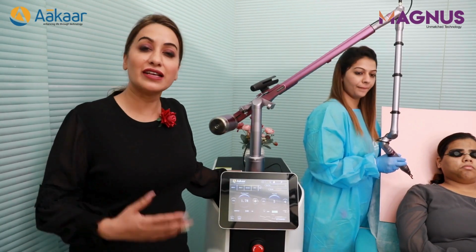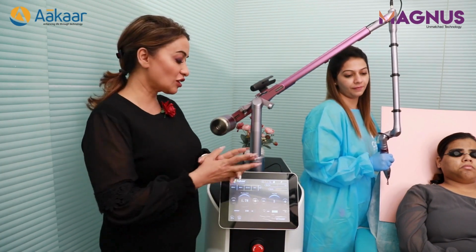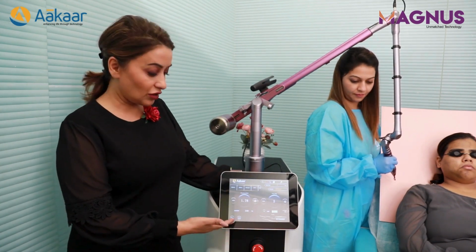Dr. Pigment, and as a dermatologist, I've always believed that one laser which is very essential to your practice is a Q-switch Nd:YAG laser. So today I'm going to introduce to you this Magnus laser, which is a new Q-switch Nd:YAG. We've been using it for some time now, and because in my practice there's a lot of rejuvenation and the laser toning that we do, I find it very ideal.